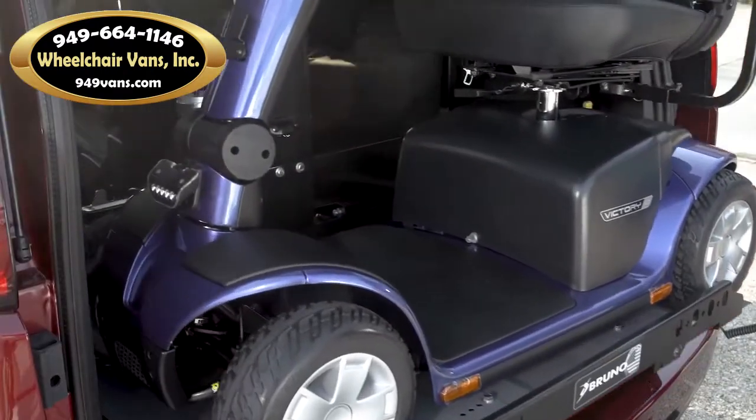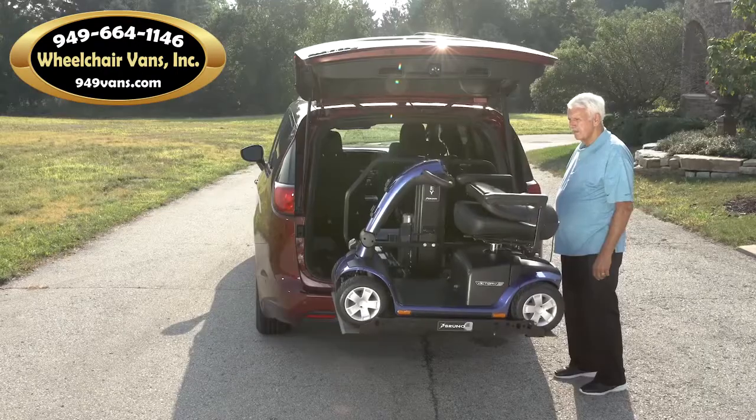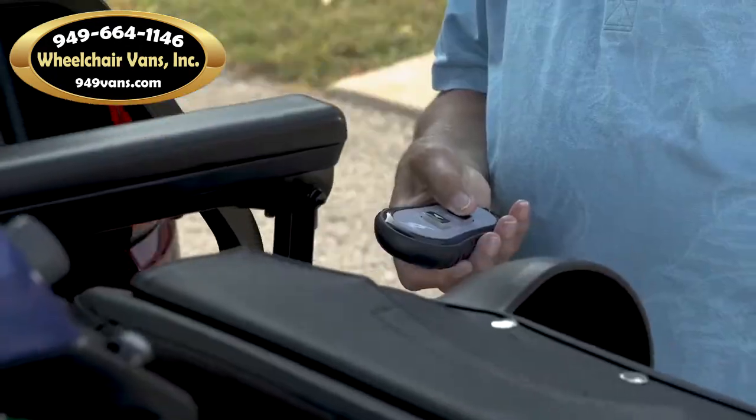Overall, the Joey is the fastest and easiest platform lift on the market. If you want additional peace of mind, optional securement belts can be added to the barrier.